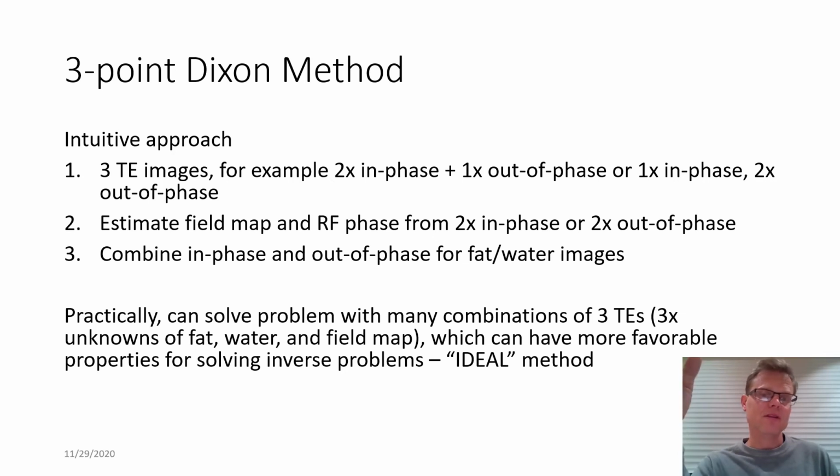It turns out, practically and more efficiently, you don't have to do exactly in and out of phase. There's these cool techniques. One of the most famous is called the IDEAL method. And there are some more clever, very interesting ways that this is done.